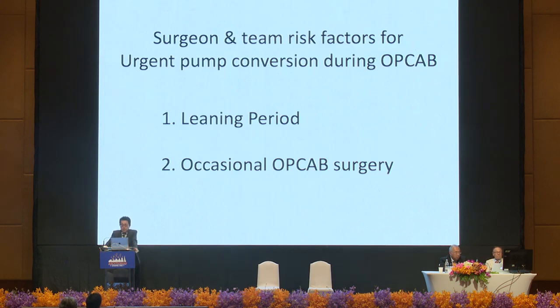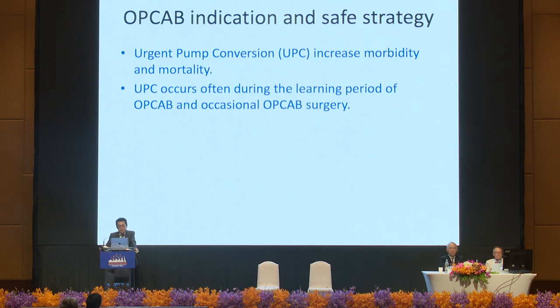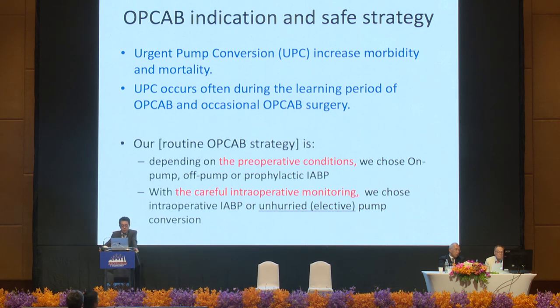Now, it seems to me we have two surgeon-related risk factors for urgent conversion. So, urgent pump conversion is a bad scenario and occurs often during the learning period or occasional surgery. So here I would like to introduce our routine OPCAB strategy, especially for the learning period or a surgeon or hospital who is trying to start their OPCAB program.